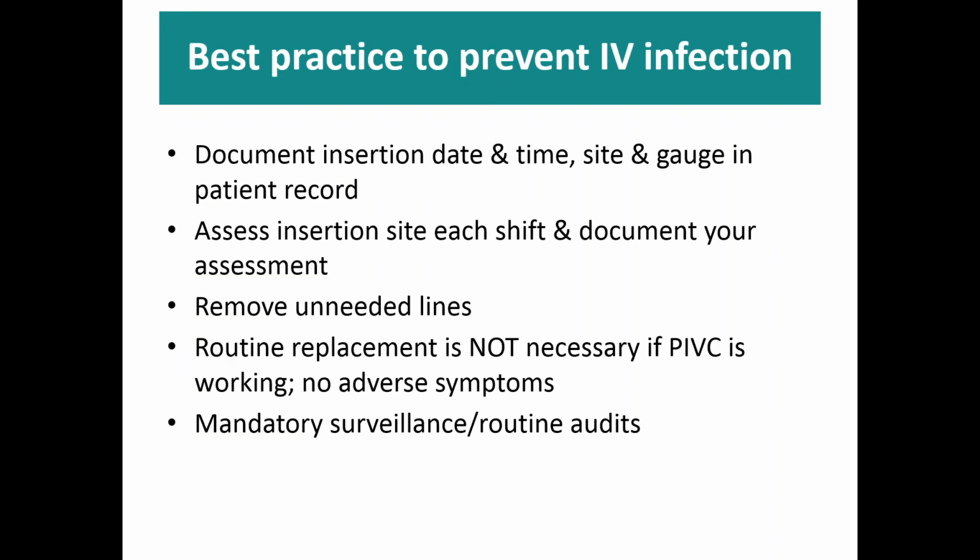Clinically indicated removal requires frequent close monitoring of the insertion site with timely treatment cessation and prompt removal once the treatment is complete, and continued monitoring for complications, including suspicion of infection. We do know patients can develop phlebitis up to 48 hours after a peripheral cannula has been taken out, so it's important to keep assessing. Clinically indicated replacement has several advantages over routine replacement, such as avoidance of unnecessary repeated skin punctures, potentially non-aseptic insertions, and reduced health costs.